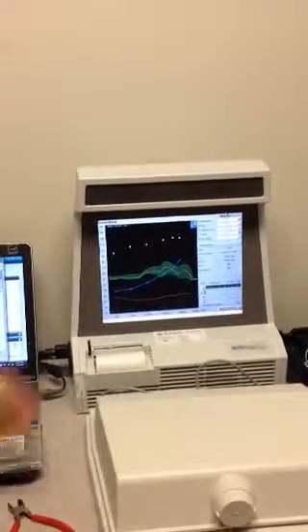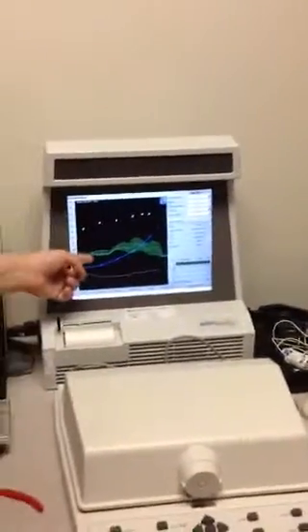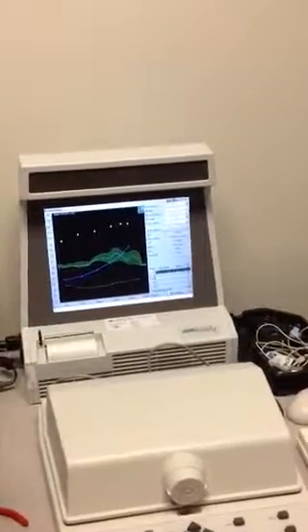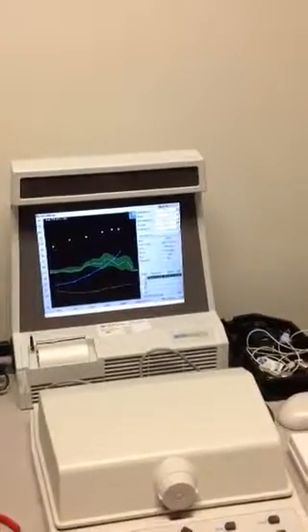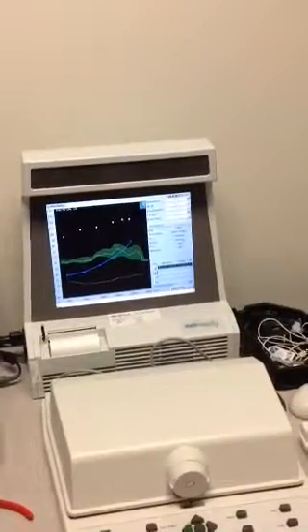So even though the channels are off, it's her ear mold because it's occluded. It's not allowing any change in the low frequencies. It's just too much closure of the ear canal, so we're not getting any changes there. So now, let's pretend that our patient says, this is wonderful, we're moving on.